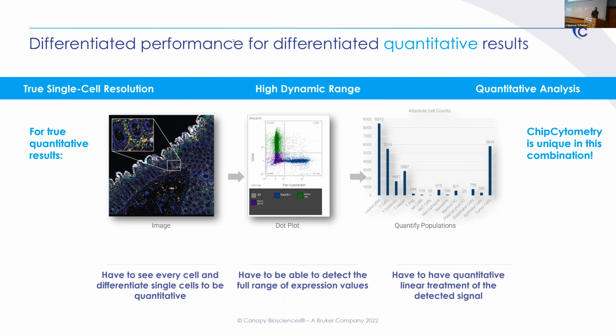But I'd rather get back to you with solid numbers. It's not like if you had 40 markers, you couldn't still do that in a day or a night. I think with the metrics we're happy with sharing at this point, meaning they're not too ridiculous and also not underselling, we can do a 20-25 marker assay on 4 samples in a day.